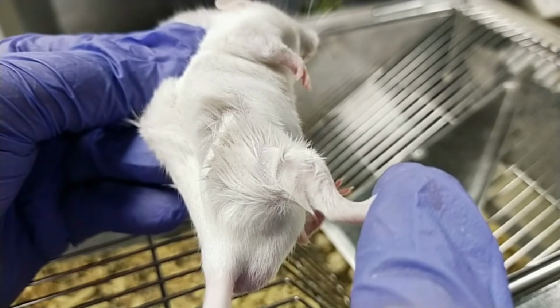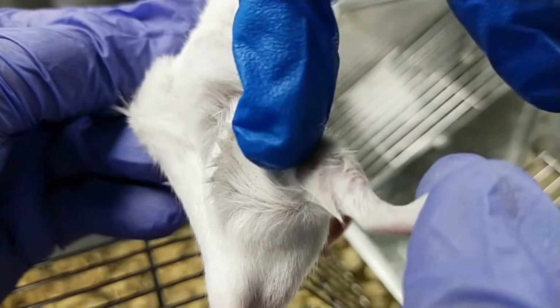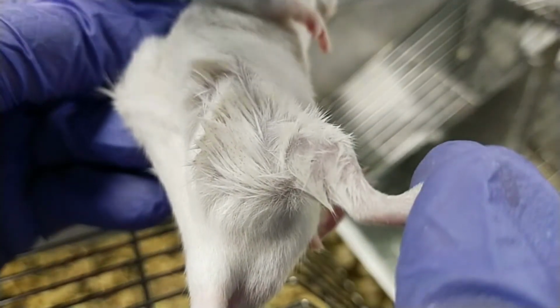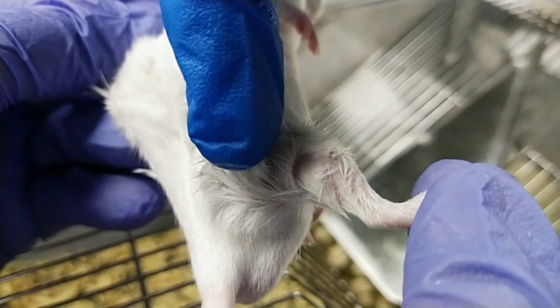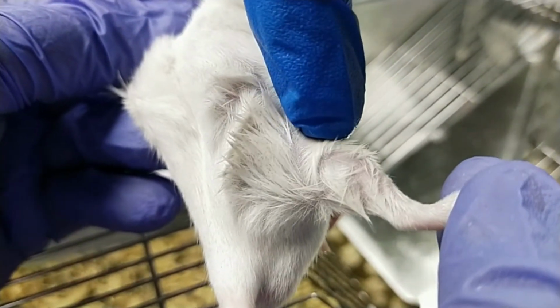Okay, and we need to be careful not to inject at the sciatic nerve, which is around this area as well. So you need to inject a little bit upper part of the thigh, which is around this area.